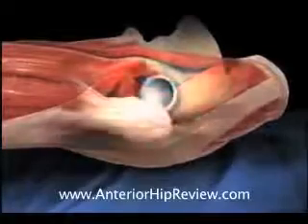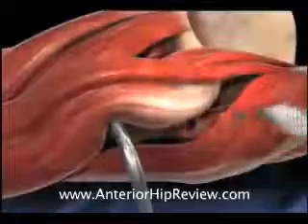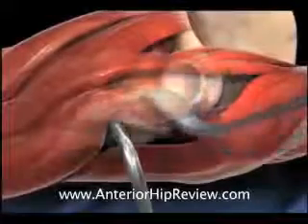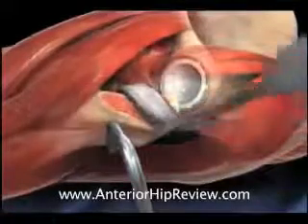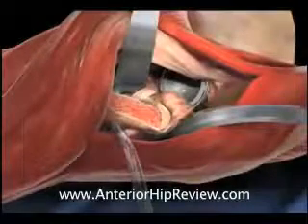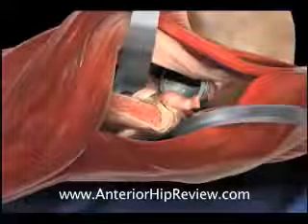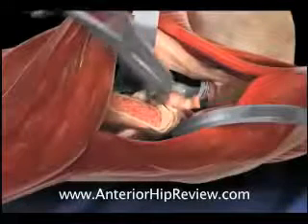The hip is then exposed by flexing the table and placing soft tissue retractors about the proximal portion of the femur, facilitating exposure of the proximal femur in preparation for femoral broaching. The soft tissues at the superior corner of the exposed femoral neck are released and a rongeur is used to remove any remaining residual neck.